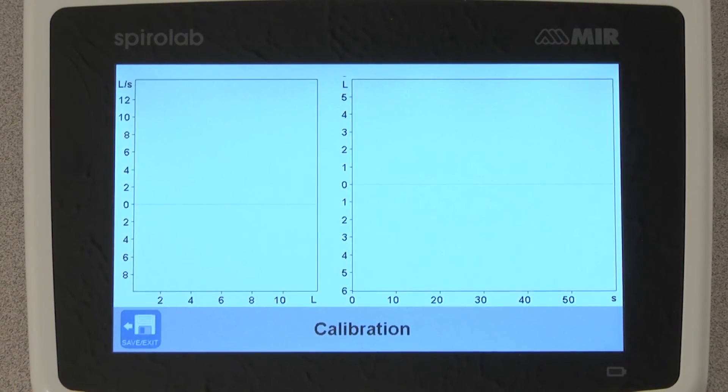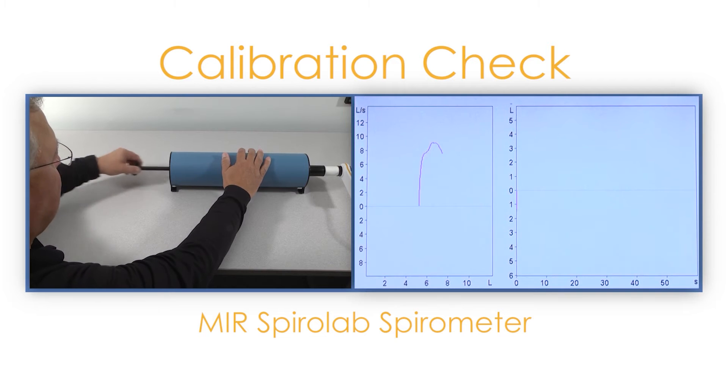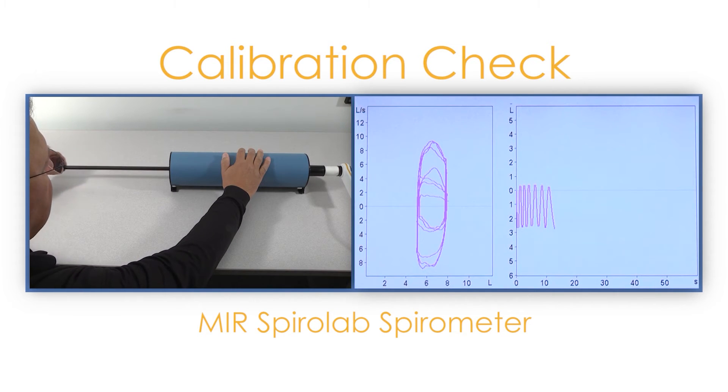This screen will show you the inspiratory and expiratory loops you will make as you do the calibration check at the three different flow rates. Begin pushing the plunger in as quickly and forcibly as possible, being sure to go all the way to the stops. Now pull the plunger all the way out as quickly and as forcibly as possible. Repeat this two more times. After you have done the high flow, push the plunger in at a medium speed and pull it out at the same medium speed. Repeat two more times.